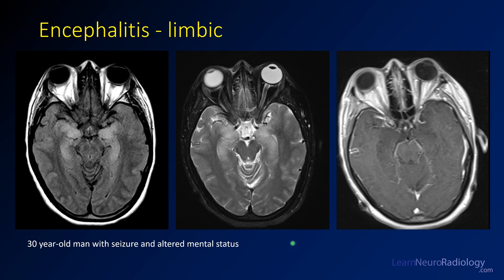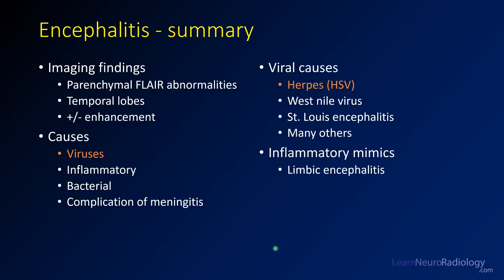This is an example of limbic encephalitis — an inflammatory encephalitis. This is a 30-year-old man with seizure and altered mental status. On FLAIR there is bilateral involvement of the medial temporal lobes, which are T2 hyperintense. On post-contrast imaging there is very little or no enhancement. This person had autoimmune encephalitis with anti-GAD antibodies. Limbic encephalitis is a non-infectious cause of encephalitis that can mimic the infectious form. In summary: encephalitis shows parenchymal FLAIR abnormalities, the temporal lobe is a favored location, viruses are the most common cause with herpes being the most serious, and limbic or autoimmune encephalitis can have a similar appearance.